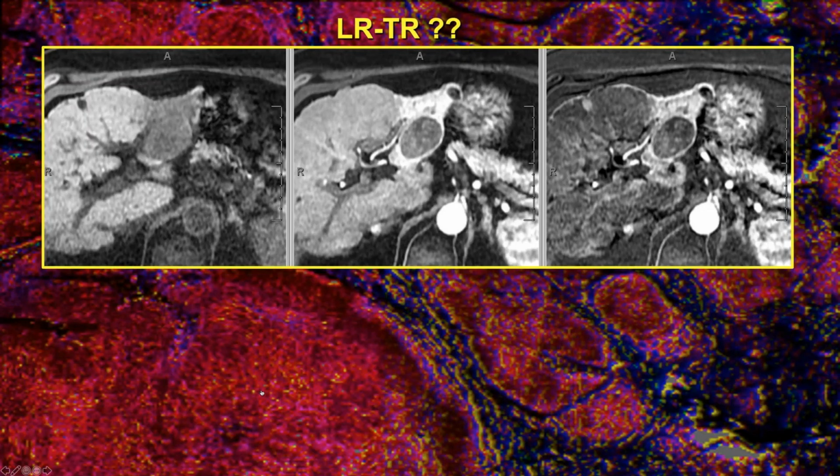This case is a bit more challenging. So the patient previously had a LI-RADS 5, definite hepatocellular cancer. I'm pointing to it here, ovoid, well circumscribed. It was hyperenhancing with washout, and then received chemoembolization. And we have some severe atrophy of the rest of the affected part of the liver. And here is the mass. So we have this markedly increased enhancement of the damaged liver because of subsegmental portal vein occlusion secondary to treatment. This happens to be a nearby cyst.